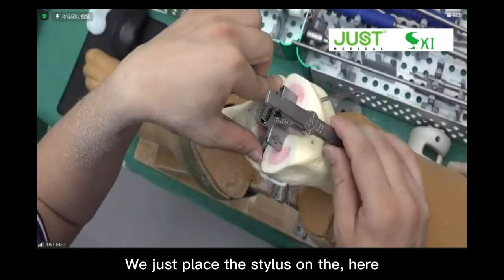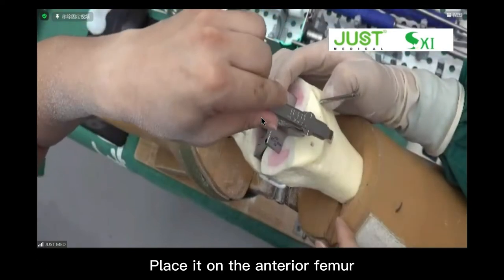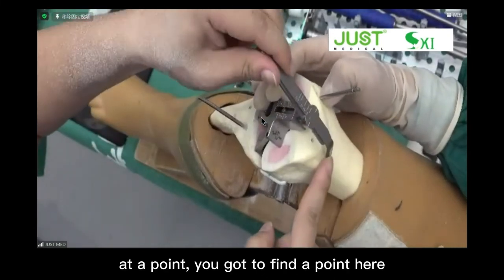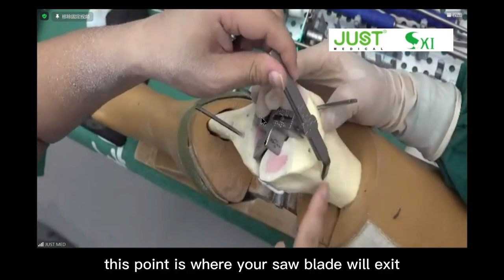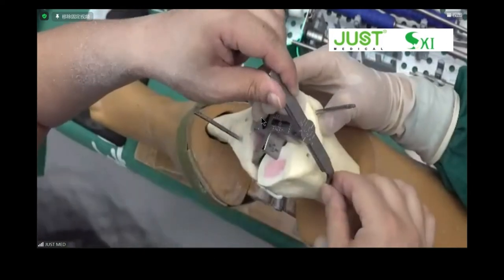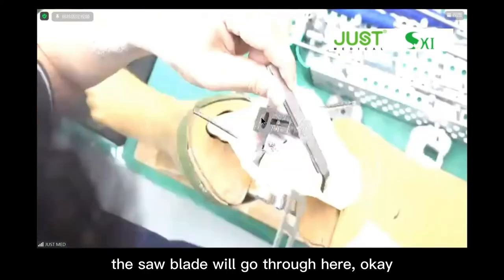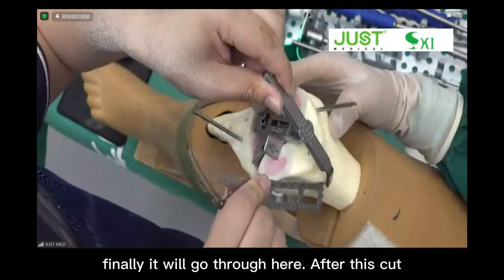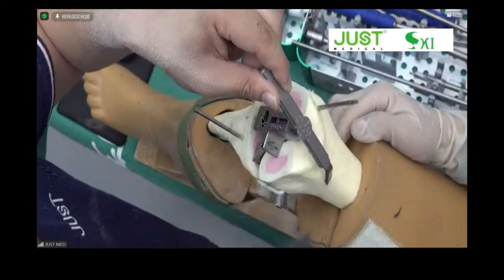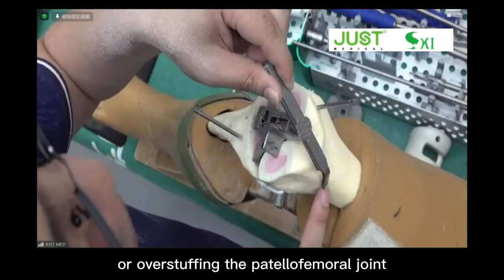You just place the stylus on the anterior femur, at a point; you have to find a point here. This point is where your saw blade will exit. For example, this point means later the saw blade will go through here. After this cut, we want to make sure there is no notch. We want to avoid the femoral notch or overstuffing the patellofemoral joint.